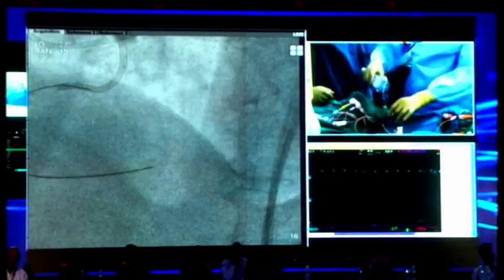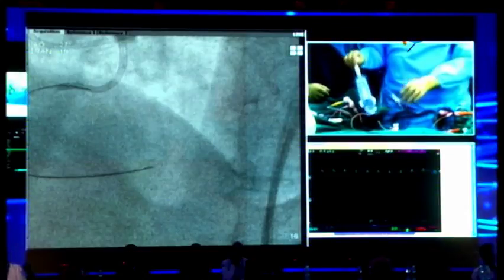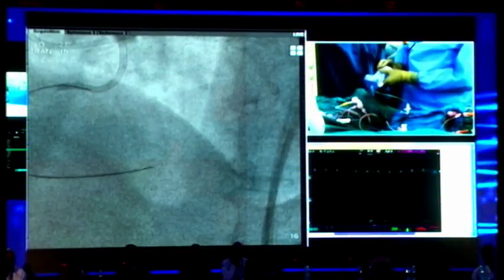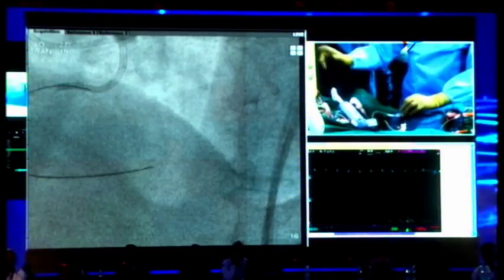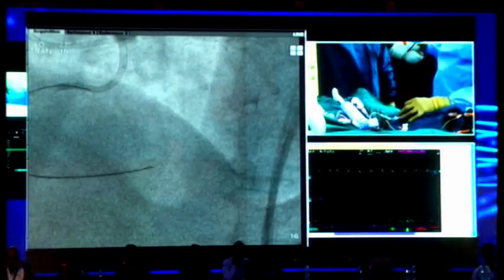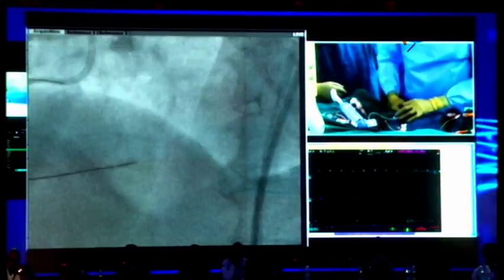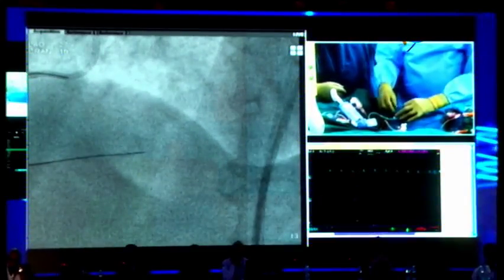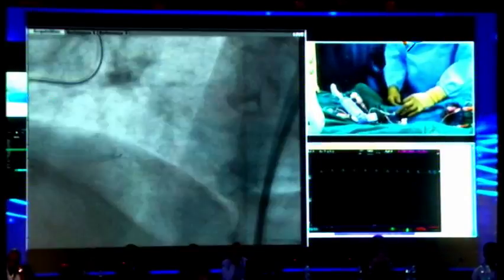Exactly. How much inflation are you giving? We're going to go to 4 atmospheres. Okay. So first you want to clear the air, like this. The key is you want really, really good prep. That's the whole idea of this. So we're going to do this, and then give me the, somebody told me there's a 50 ml syringe with a luer lock, right? Get that. Thanks. So you inflate the balloon before you pull off your Miracle wire? Yeah, I do. So that's actually, okay.